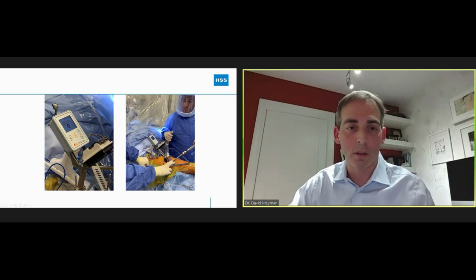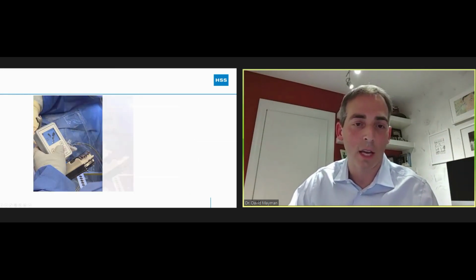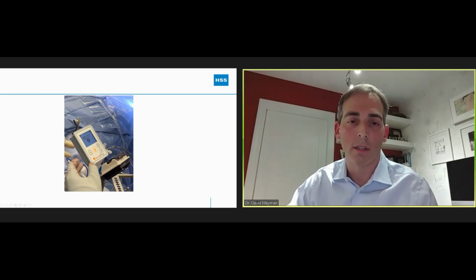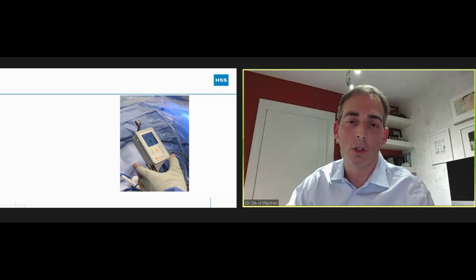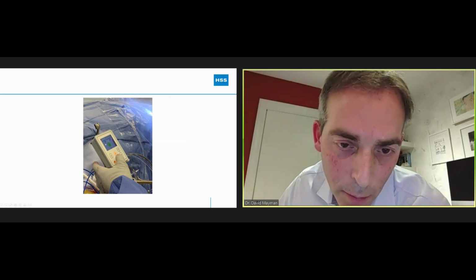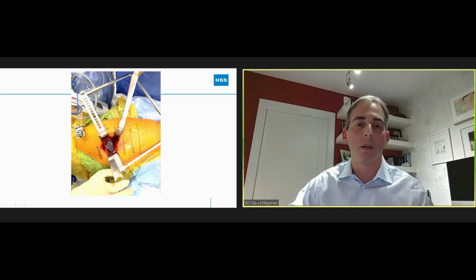So the device goes back on the clamp. You push a button that's basically saying, hey, are you set up to measure the acetabulum? And then you move this battery-powered part from the device here onto the acetabular insertion handle when it gives you the green light to do that. And then it gives you real-time acetabular component position. So it gives you inclination and anteversion, both in the functional pelvic plane. So you can see in this case, this acetabular component is at 38 degrees of abduction and 25 degrees of anteversion.